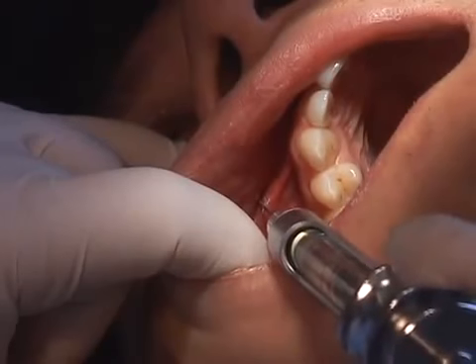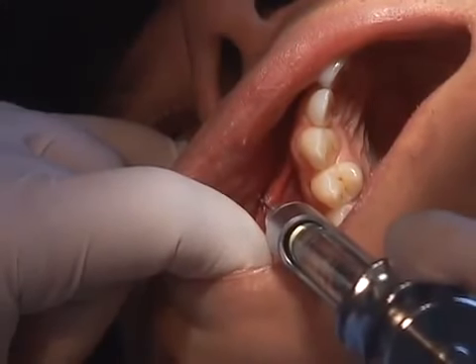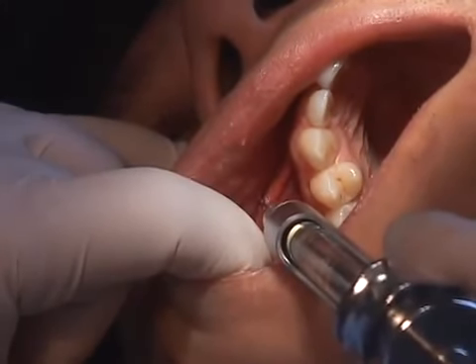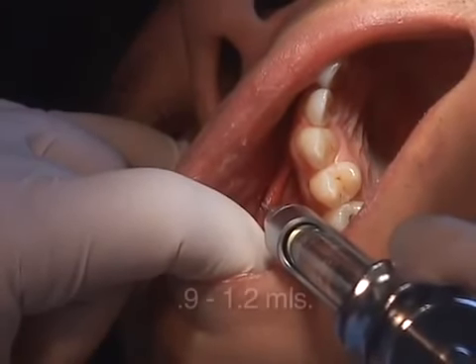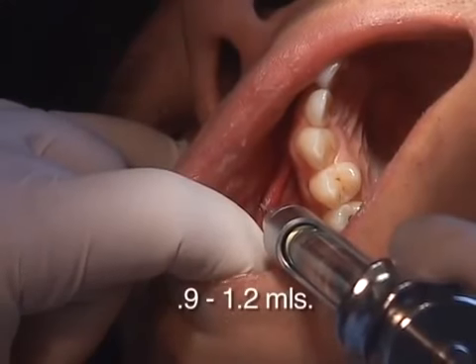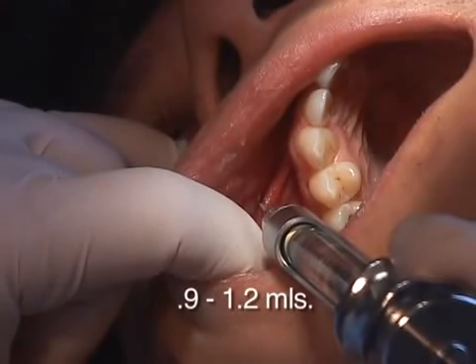Once the bone at the roof of the infraorbital foramen is contacted, withdraw the needle 1 millimeter. Perform aspiration, and if negative, proceed to deposit 0.9 to 1.2 milliliters of solution.